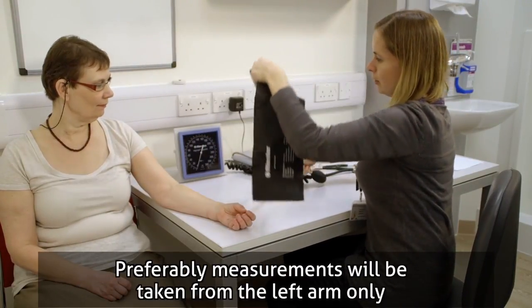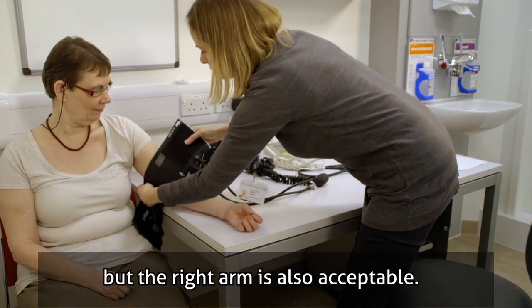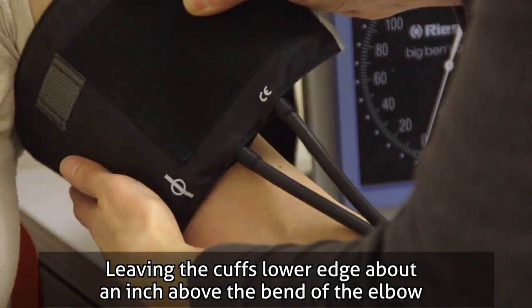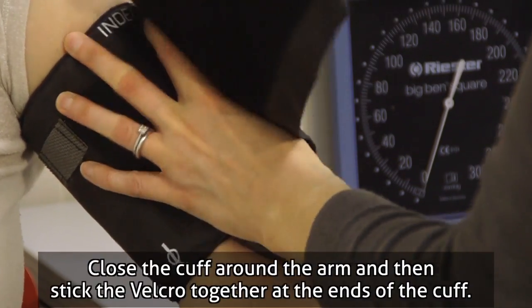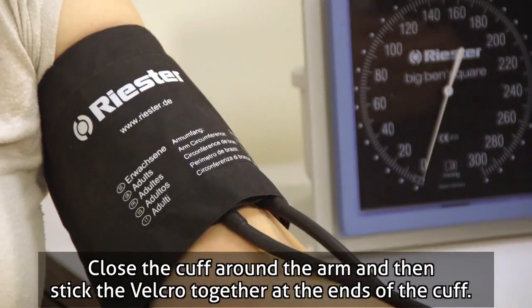Preferably, measurements will be taken from the left arm only, but the right arm is also acceptable. Leaving the cuff's lower edge about an inch above the bend of the elbow, place the cuff over their bare arm, close the cuff around the arm, and then stick the velcro together at the ends of the cuff.